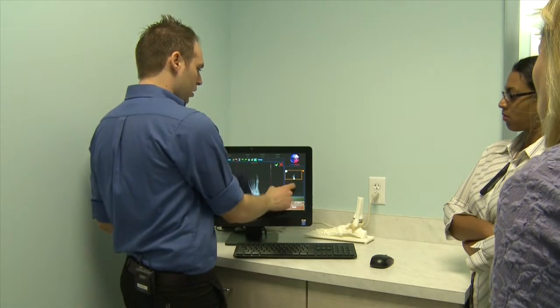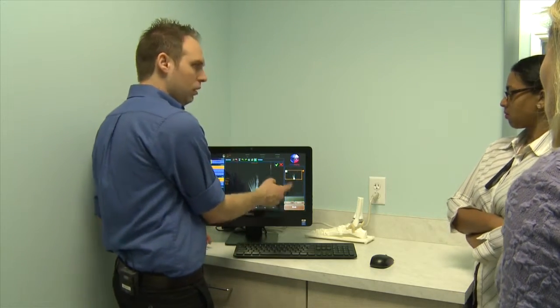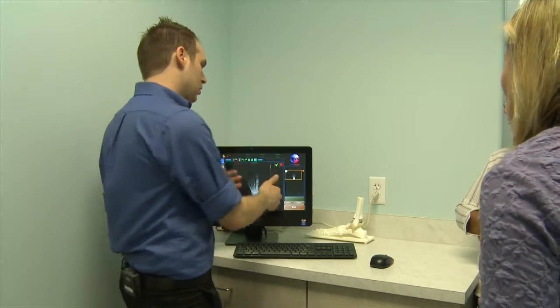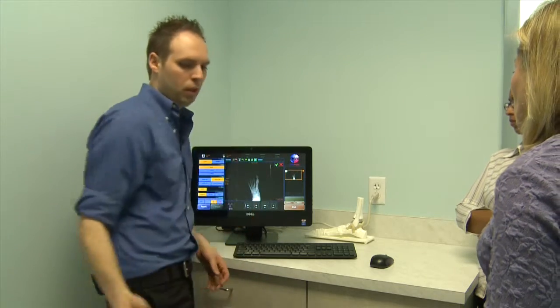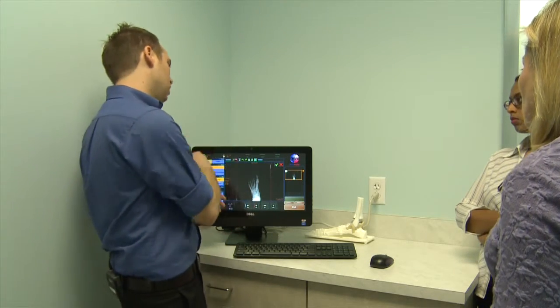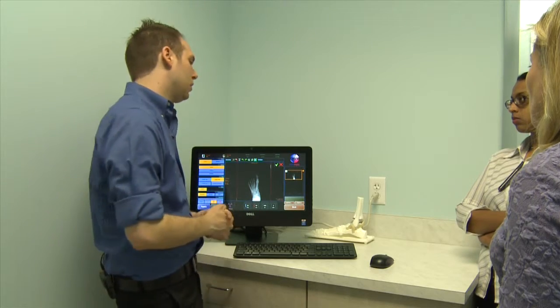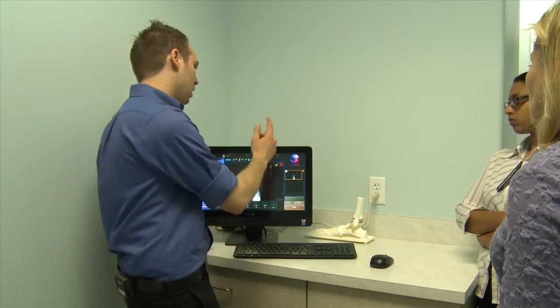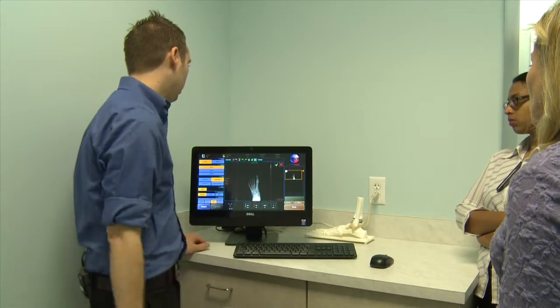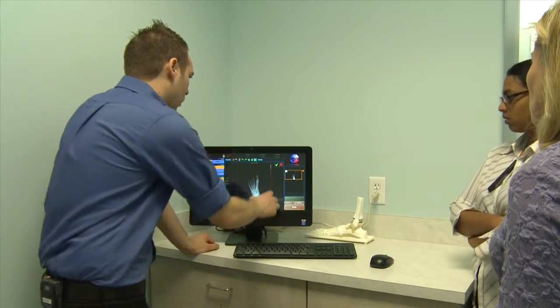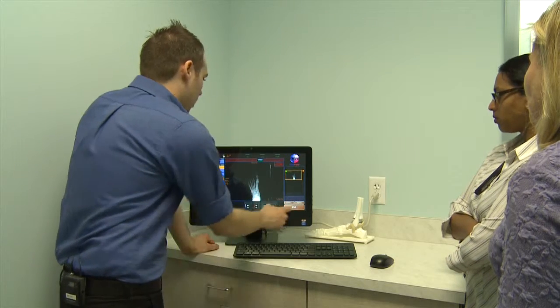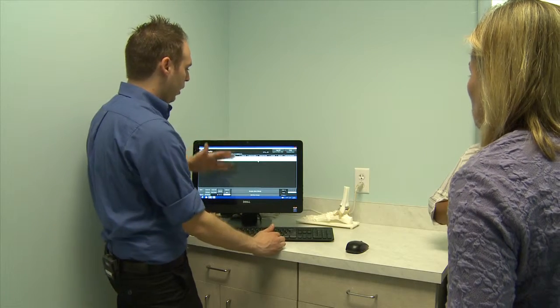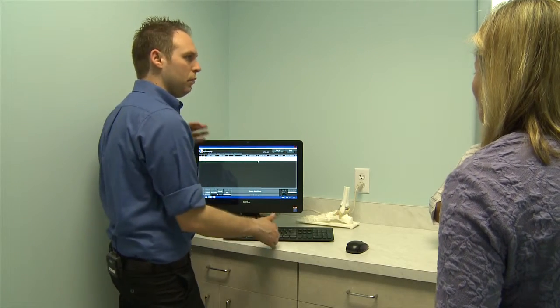Once you're done, you can go through all the thumbnails of the shots you took. While taking x-rays, you can accept each one as you go, or continue taking them all and then accept and reject at the end. Once finished, accept, close out of there, open the study list — the most recent study will be at the top, and it'll keep pushing others down with multiple pages.